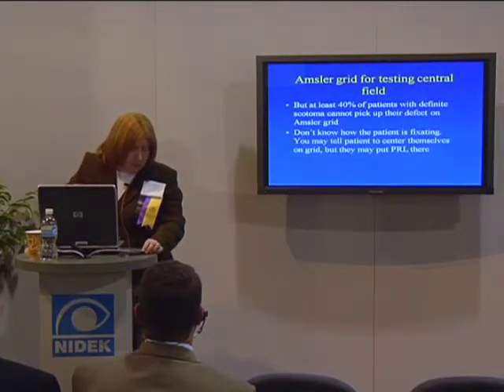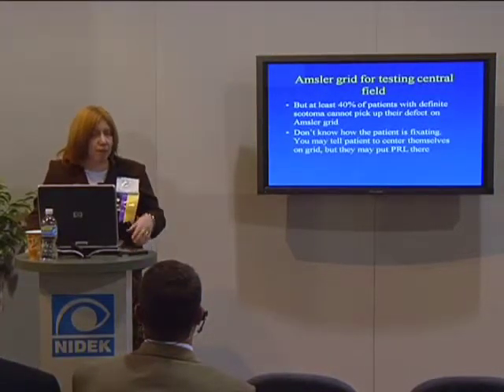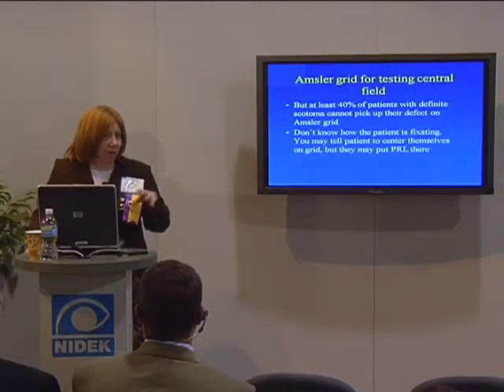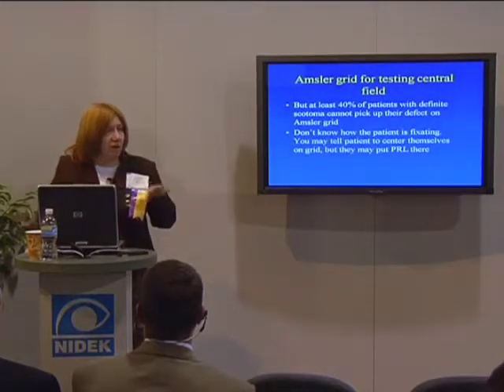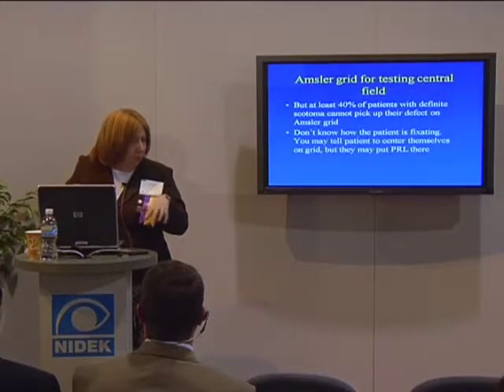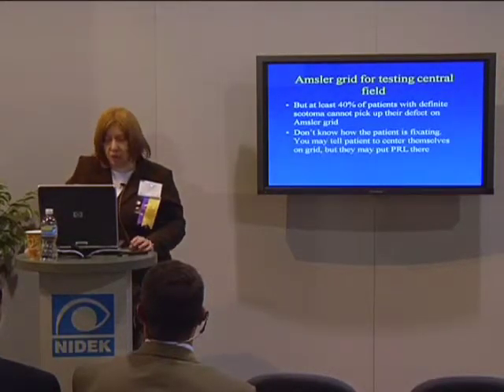But the other thing is there was a study done in the 1980s at Wilmer, and what they did is they took people who had gotten heavy laser photocoagulation, which was the mainstay of treatment for wet macular degeneration then. So that kind of laser treatment destroys all the underlying layers. So those areas were clearly blind spots. There was no question.